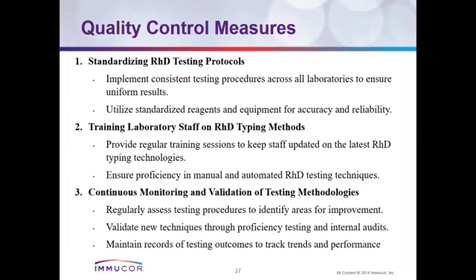In my opinion, I am also interested in making sure that the weak D test is part of the proficiency testing manual that is given to you. You don't only do ABO. If one reacts, turns out to be rhesus negative, you should proceed and do the weak D. So it should be part of the proficiency testing.